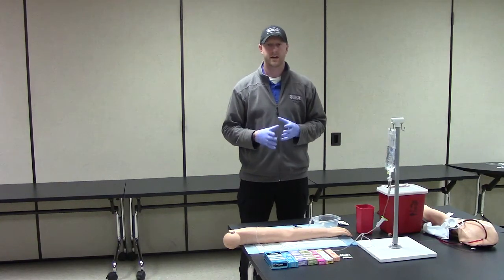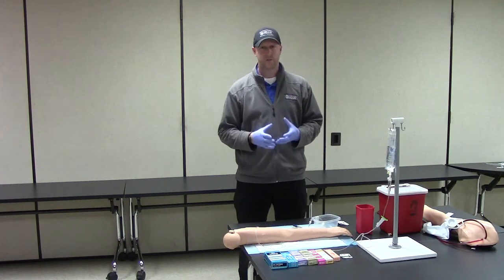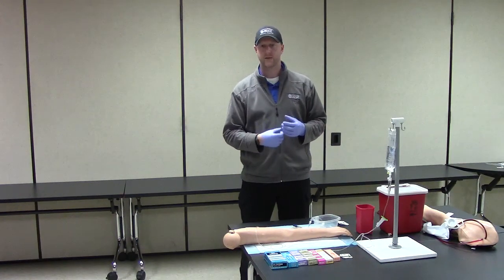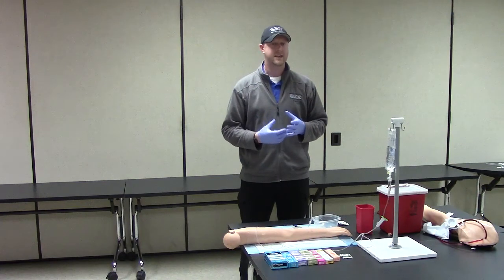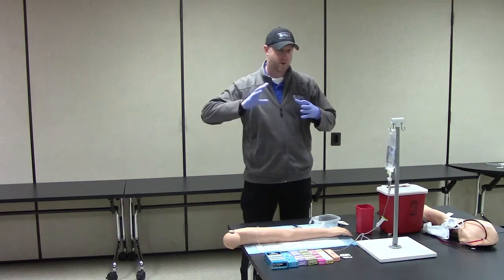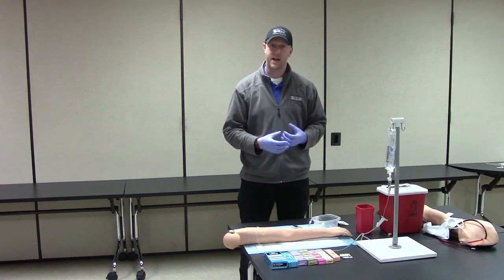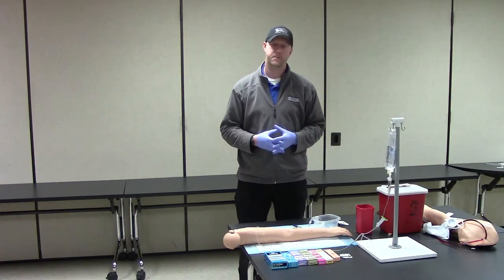However, you will notice that I perform the procedure a little differently from what the exam sheet says, which is to stop flow when you administer. When you're giving medications like Narcan, you actually want to leave the fluid running, at least at a TKO. That way the medication is being pushed into your patient and we're not just flushing the whole lot of medication at once, especially with a medication that is supposed to be a slow push, like our Narcan.